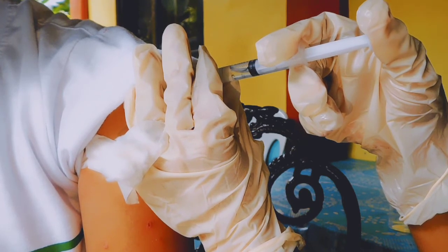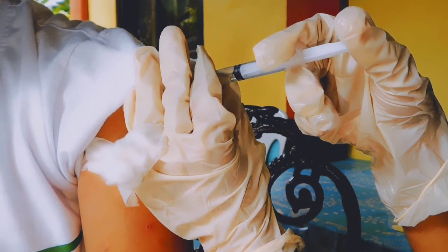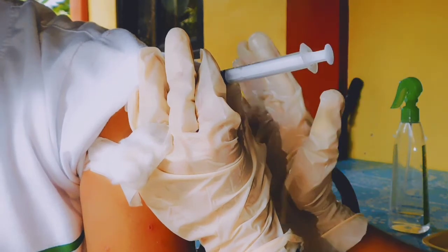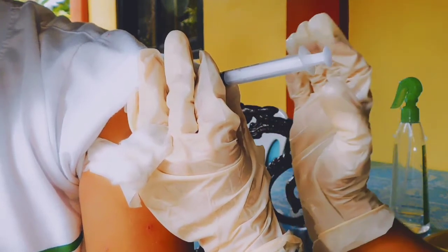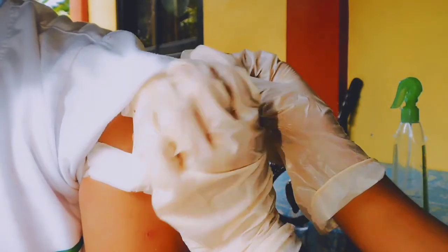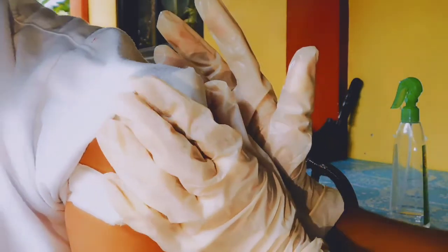One, two, three, four, five, six, seven, eight, nine, ten. Then just in your mind, count one. After the injection, wait 10 seconds. Then withdraw the needle smoothly at the same angle of insertion. Release the skin. Discard. Then apply gentle pressure at the site with a dry sponge. If bleeding occurs, apply pressure with dry, sterile gauze until it stops.